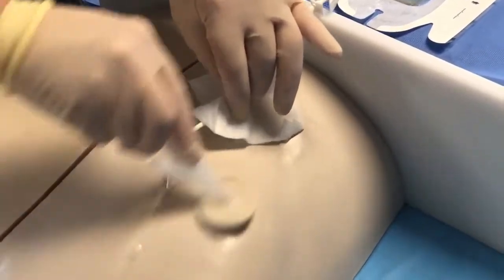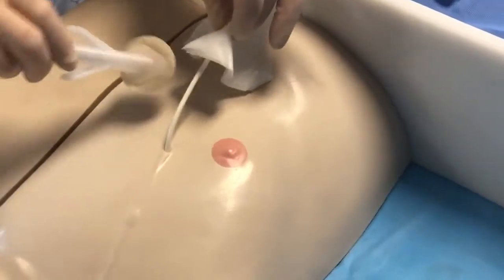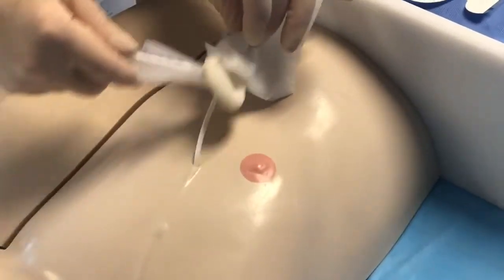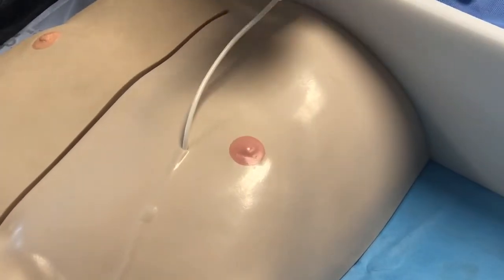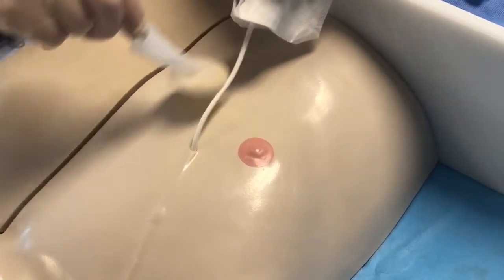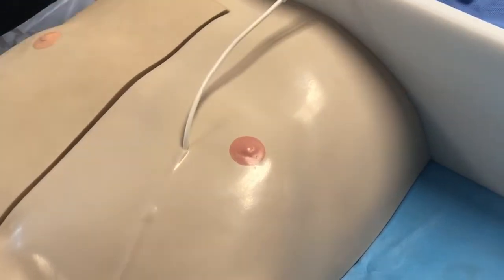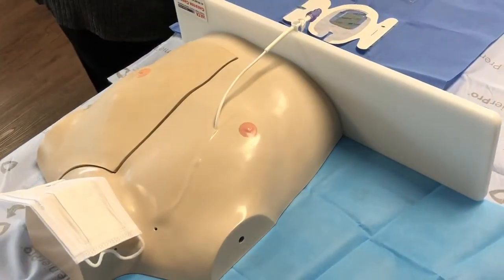Using the back side of the chlorhexidine swab, scrub the catheter that was under the dressing. Discard the swab and the 4x4. Allow the skin to completely dry.